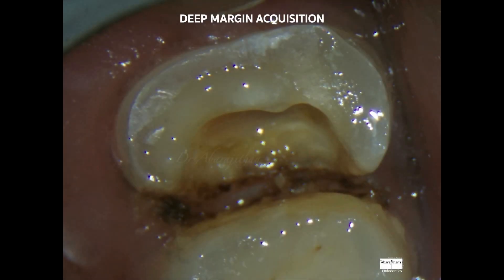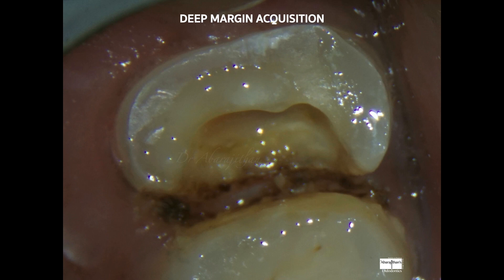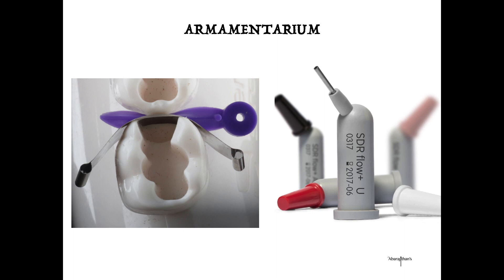Following this, I have now exposed the gingival seat that is subgingival and now I need to elevate it. As mentioned in a previous EndoTale, the matrix of choice I prefer for deep margin elevation is the saddle matrix with a good wedge. For elevating the margin, the material of choice is composite resin — my personal choice is bulk fill flowable composite, which is much easier and more predictable because of its self-leveling property. In this demonstration we are using SDR from Dentsply, though there are other brands that also have bulk fill flowables.